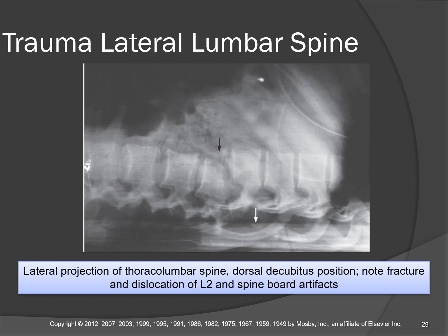Okay. So now, will you be able to remove that? Hard to say. Okay. I did have to cut a bra off, I remember, at least one time in my career. So just, the nurses have trauma scissors. If you don't have a pair of your own, run over to the ED, tell them you need trauma scissors, tell them you need to cut the bra off of your trauma patient to get them off the backboard.